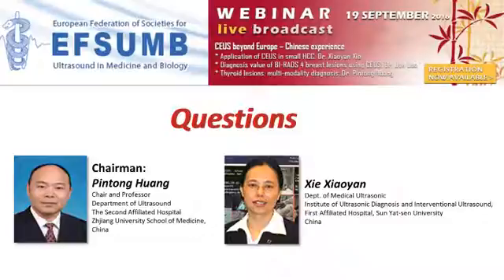Yes. I used the coagulation mode to break the feeding artery. Sometimes if the coagulation mode is not effective, it doesn't work, I use the ablation mode.